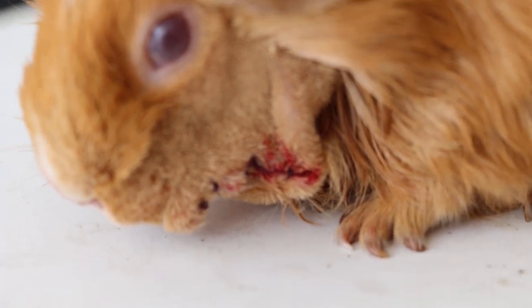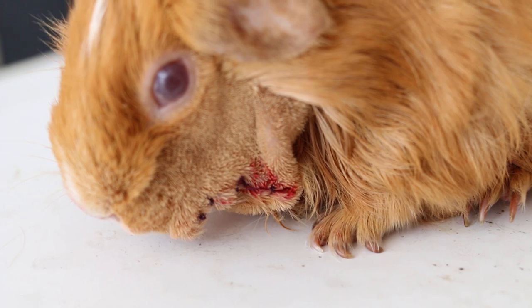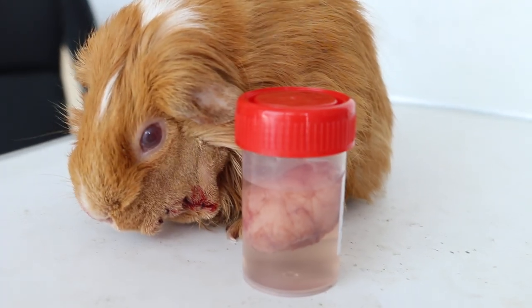Absorbable sutures, blunt dissection after incision, electrosurgery, blunt dissection. And this is the tumor from the lower chin area. Must have been in there for a long time, supposed to be near the mouth.